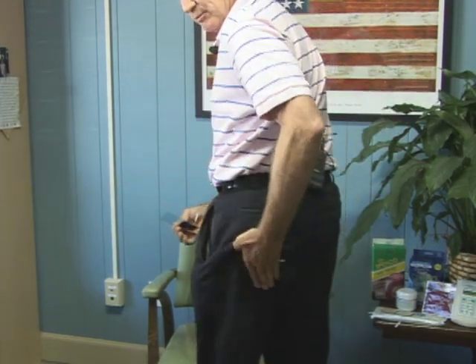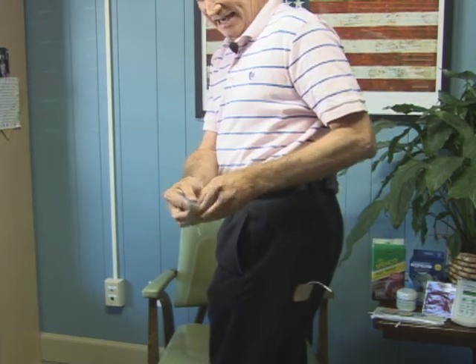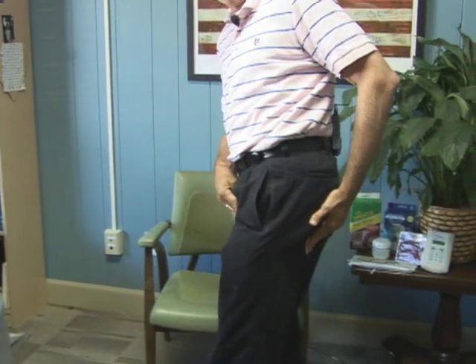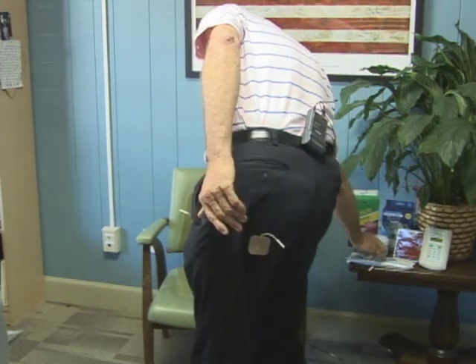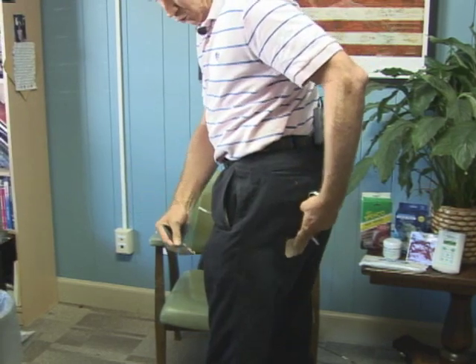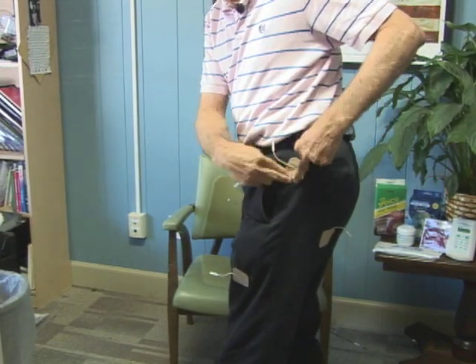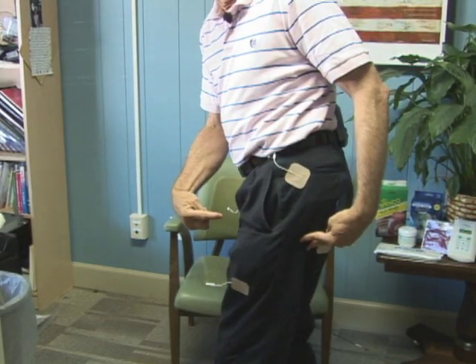You've got a very sensitive spot — you touch it, it radiates all over — put an electrode there, that's a great place. Now because the pain is there and it's deep, we may want to take the other electrode and go to the front right on the leg here. Why? Because electricity is flowing through the target area where you're feeling it. At the same time — and you can do this with TENS or interferential — we may want to put an electrode on the outside edge and another electrode up here higher on the same channel.